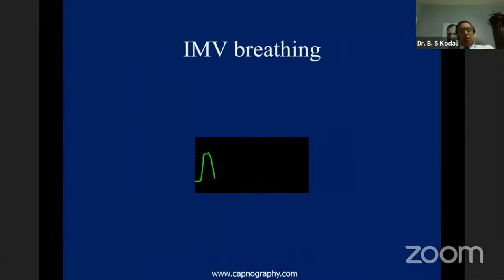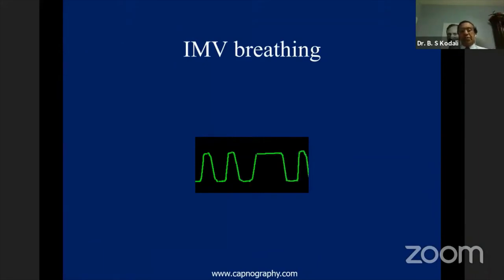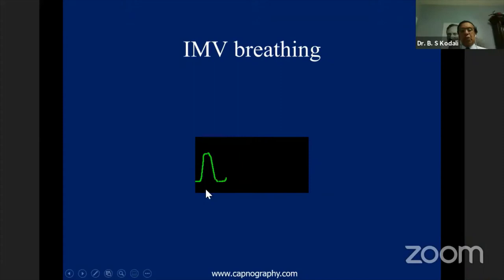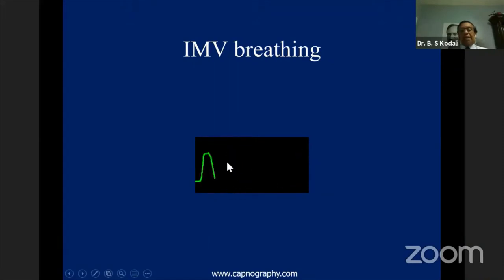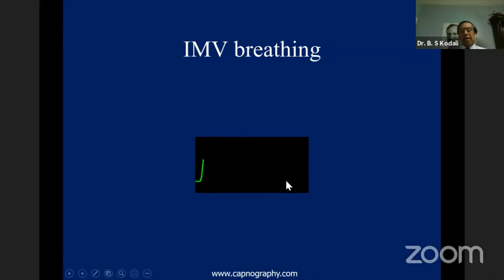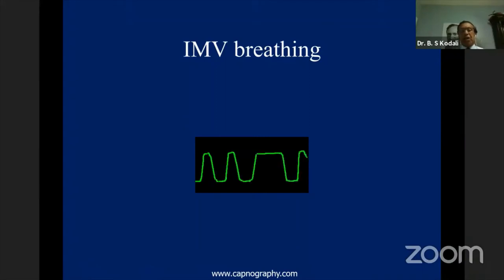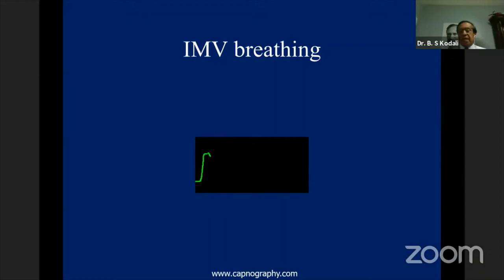When a patient on a ventilator or recovering from anesthesia shows spontaneous breaths alongside ventilatory breaths, and the height of the spontaneous breaths is the same as the ventilatory breaths, it tells us that the patient's respiratory effort is more or less equal to the ventilatory breath and therefore the patient is probably ready for extubation.